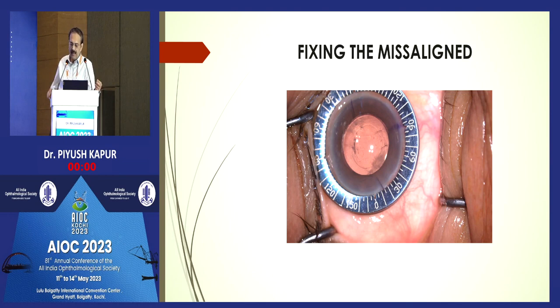When I went back and saw the data of this patient, the optometrist who had calculated the K values and given them for the toric alignment had just reversed the 180 and the 90, and we landed up with the lens placed accurately, but at a 90-degree misalignment.